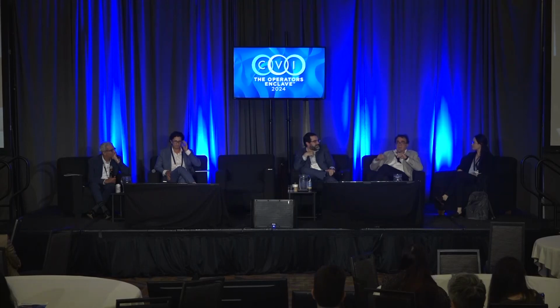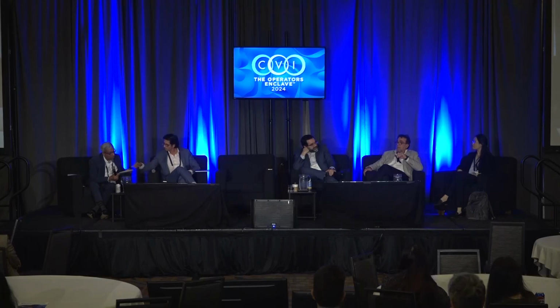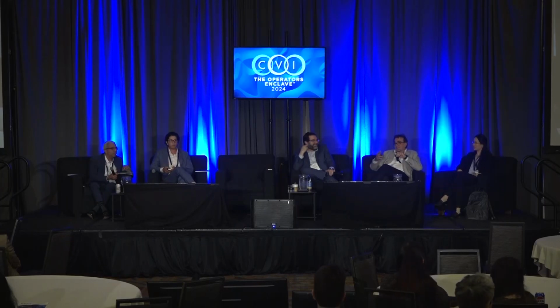What we were considering, and we are still thinking about that, is instead of a transfemoral access, to do transjugular access, and then have the probe outside the sterile field and manipulation from the outside field. That would lead then to the images being upside down, so 3D ICE images are already difficult, so there'll be even more. But those were the possibilities at that institution.